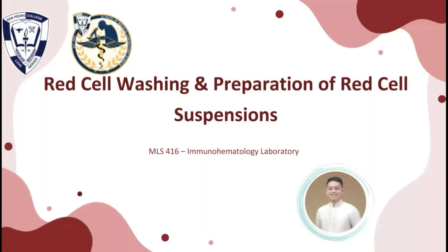Good day everyone. I am going to teach you how to wash red cells and to prepare red cell suspension with various concentrations.